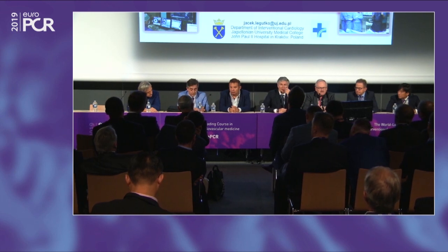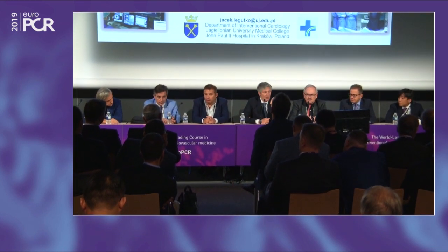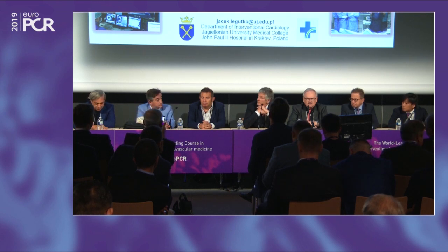But of course, it's not a bad thing to do a final pot with a non-compliant balloon in order to be sure that the vessel is well open and the stent well opposed and well expanded. I think also that the fact that there is no metal or very little metal at the level of the carina is also something very positive, because we know that usually there is no plaque at the level of the carina, so we don't need a lot of metal at this level. So I think it could be a very positive thing also for the mid and long term follow-up.